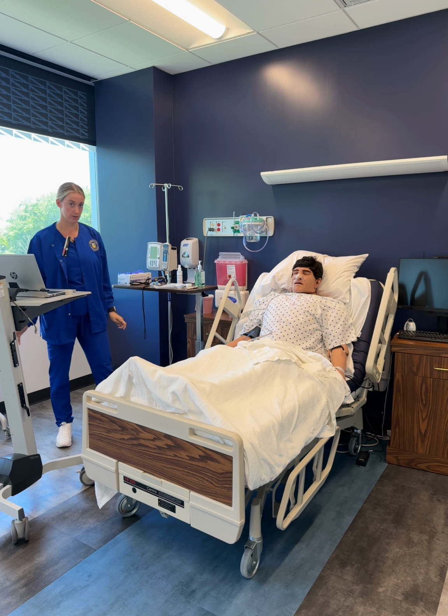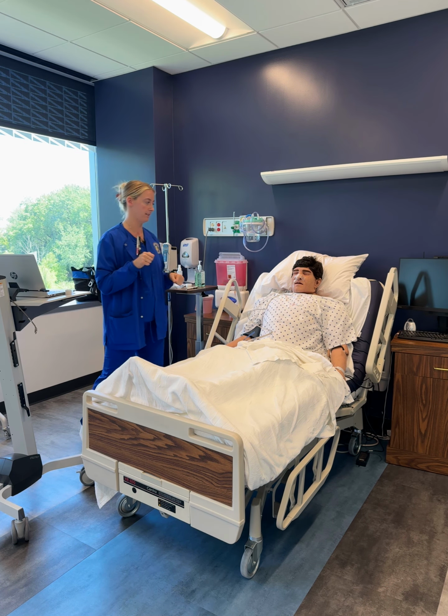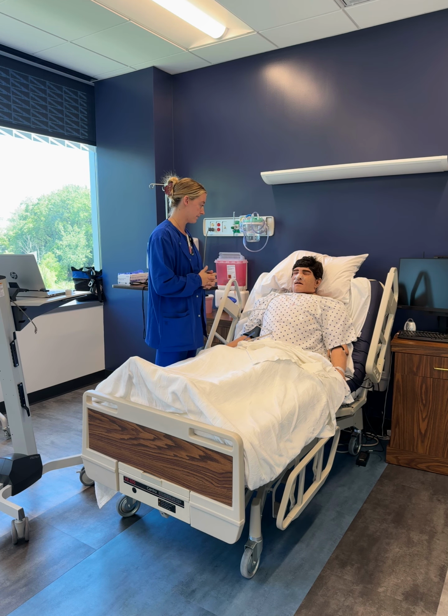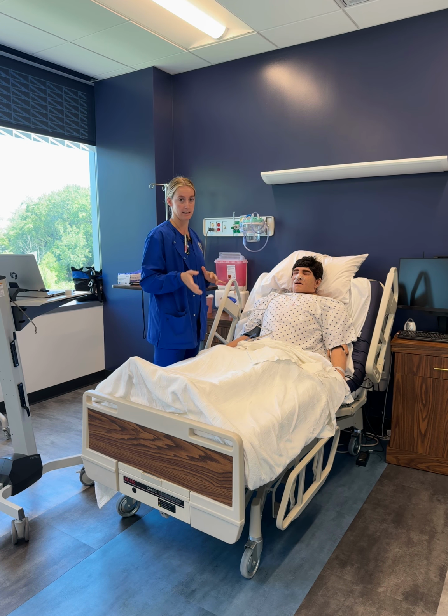I am now going to do the removal of the NG tube. I'm going to knock on the door. Hello, my name is Bree. I'm here to do the removal of your NG tube due to the resolve of your bowel obstruction. Can you tell me your name and date of birth? It is concurrent with their wristband. Do you have any allergies? Patient denies any allergies.